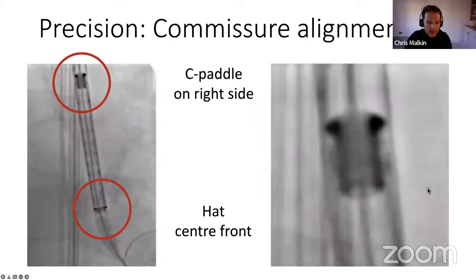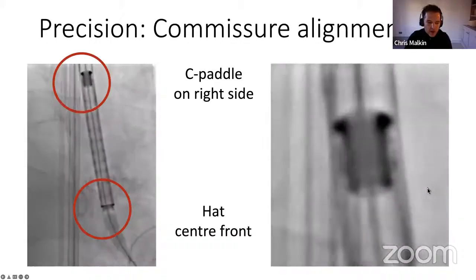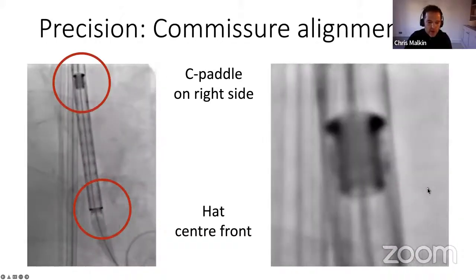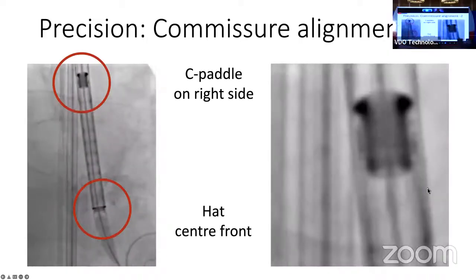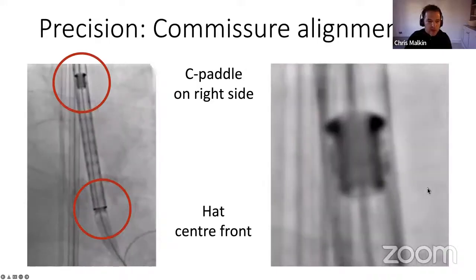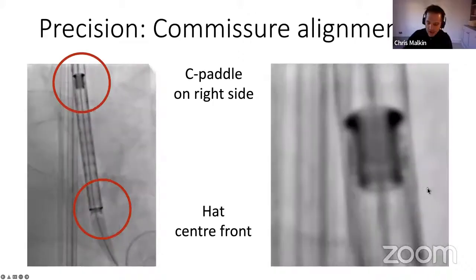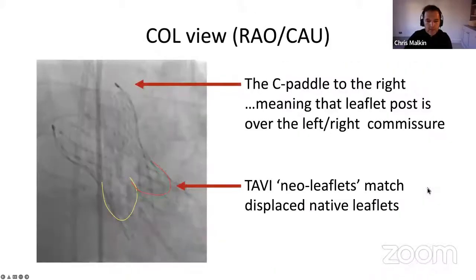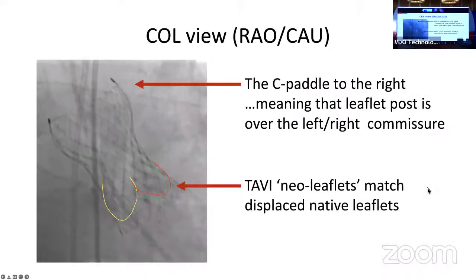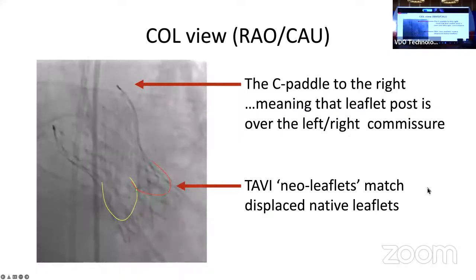And in the cath lab, what you see, of course, is this. You don't see the valve, you don't see the commissures. You have to rely on your CT that you've done beforehand to know where you're working. And you can see the hat marker in the lower red circle and the C-tab on the right side of the screen in the top circle. This valve is going to expand with its commissures next to the commissures of the patient. And when you deploy the valve, what you should see in the cusp overlap view is the C-tab on the far right of the screen. And this valve has been implanted, preserving commissural alignment.